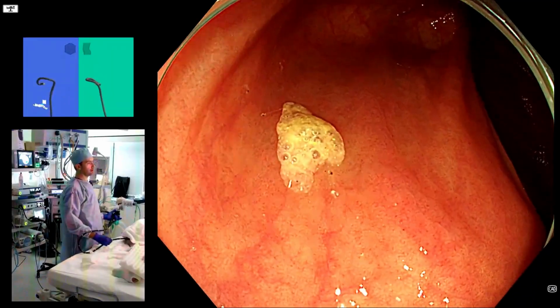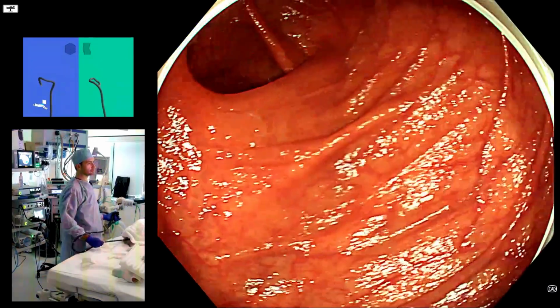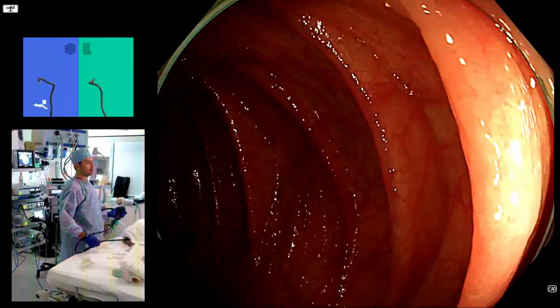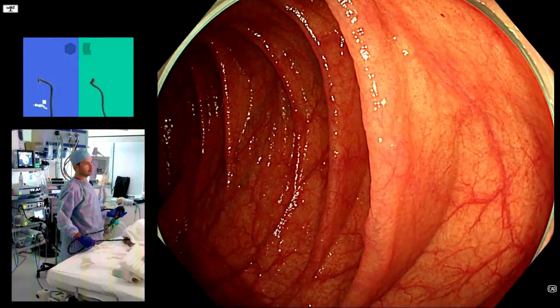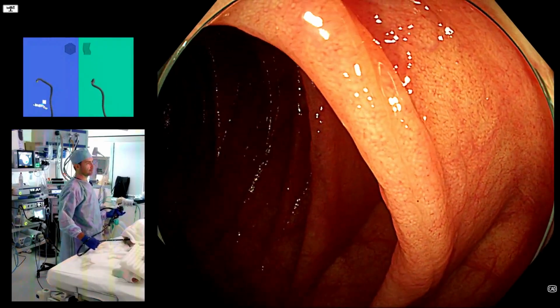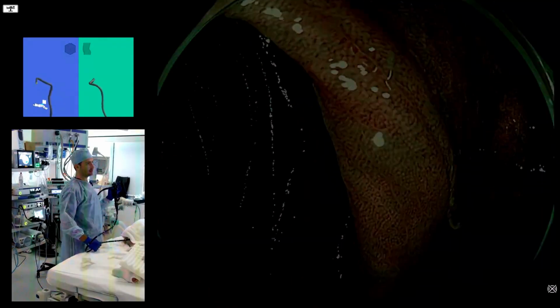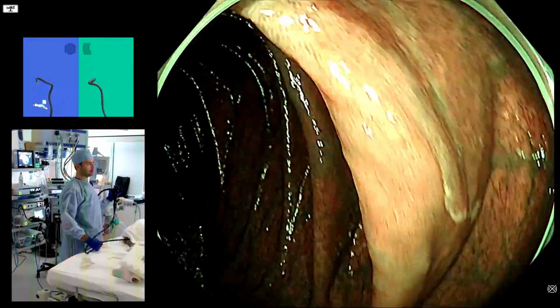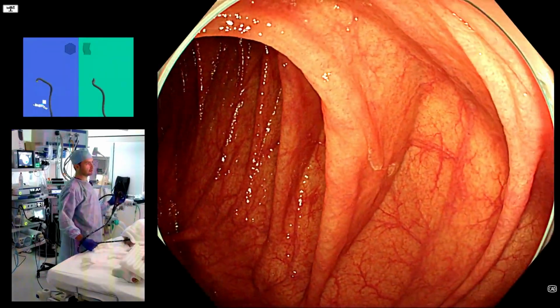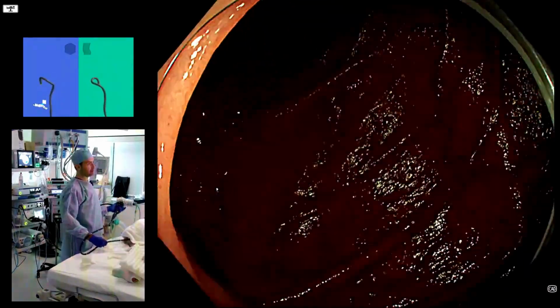So I'm really looking behind, really spending a lot of time looking behind here. And we're just going to do this, and I make no apology for this video being long, but you might understand the point we're trying to make. So is that a polyp? Good question. So we don't know. We look a little closer. Maybe it's still not clear whether that's a polyp or not. Not registering more detections right now with the narrowband imaging.